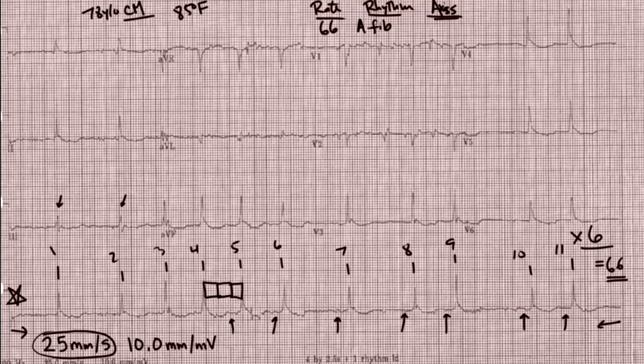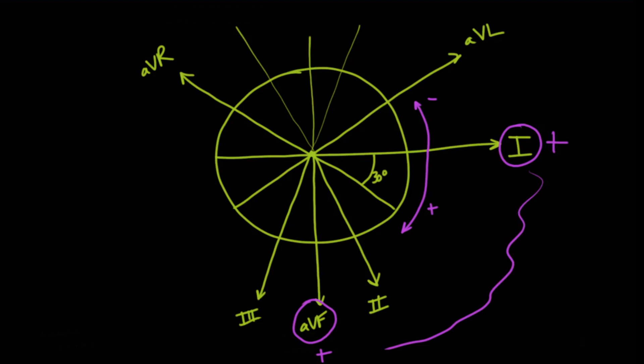We're going to look at lead one, which is right here, and we're going to look at AVF, which is down here. Notice that in AVF and in one, we both have a positive QRS complex. So what does that mean? That means that our axis is going to be somewhere in this quadrant, which is normal. That's where it should be.